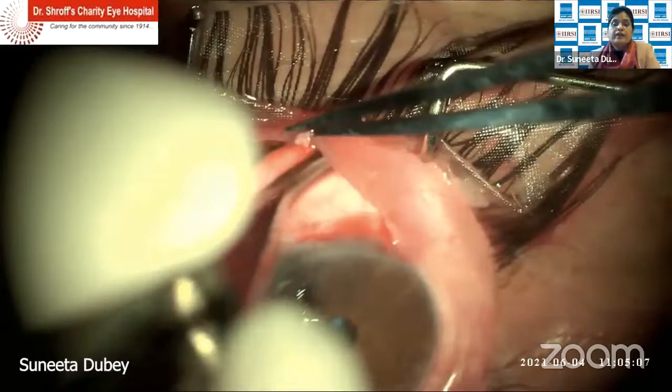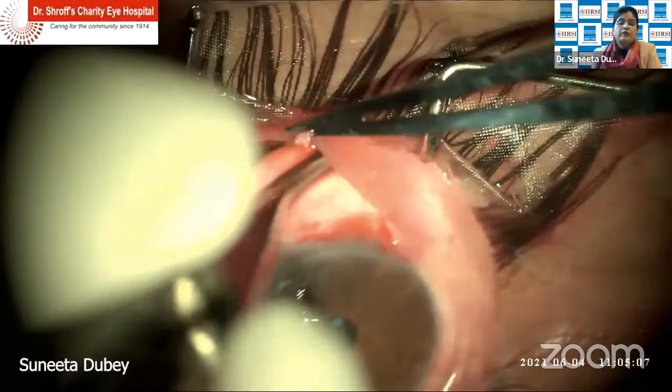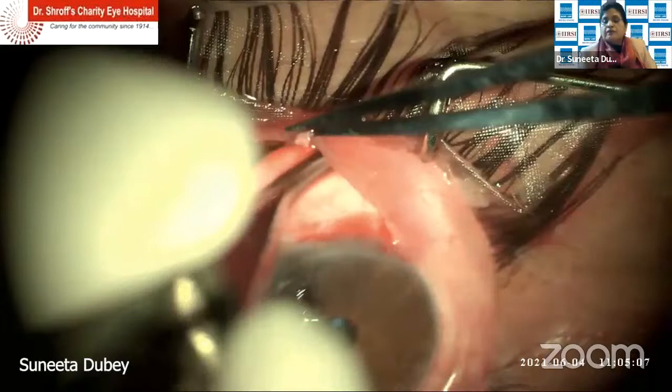So, Dr. Murli, you said that you use only one sponge. Yes, most often I use only one. But the Moorfields safe technique advises that you use multiple sponges in the deep fornices, because wherever you put the sponge, the bleb is going to form there. If you just use one, there are chances it will be more anterior, and the chances of a thin cystic bleb are there. I use three to five sponges.